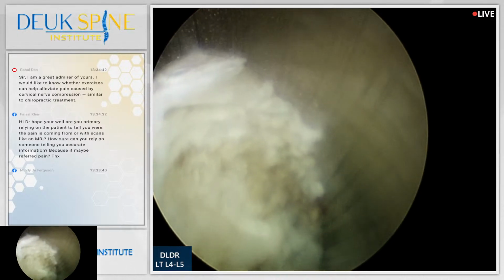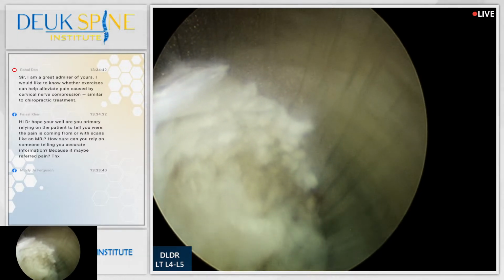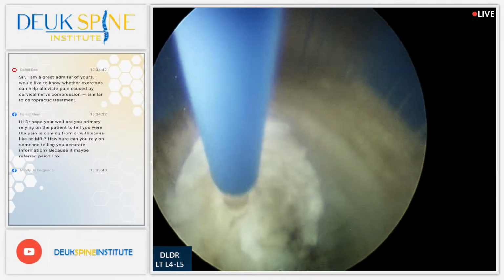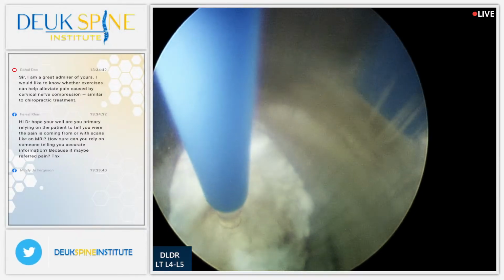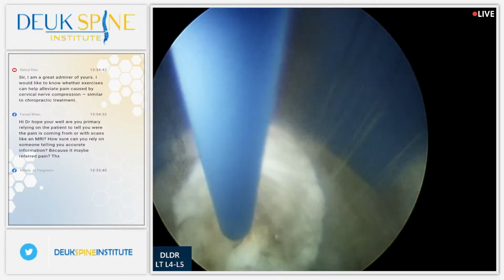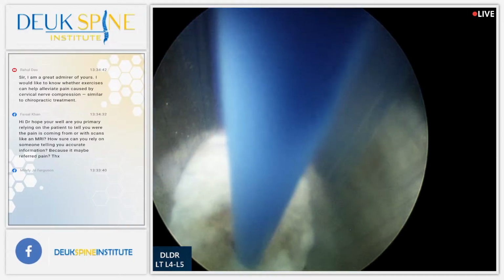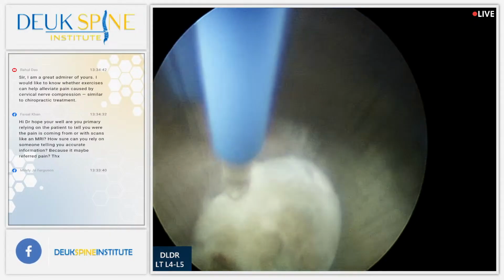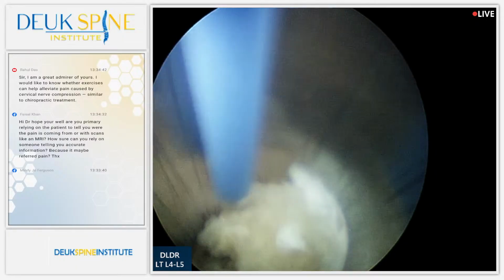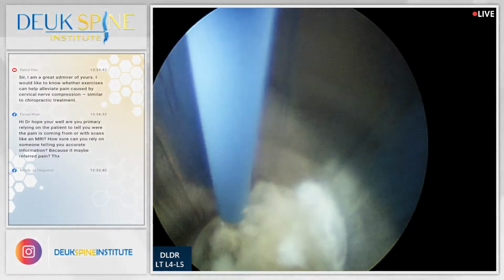And welcome back. We have been pulling out pieces of herniation now for the last 5 minutes. We are using our laser. That's the laser ahead of you. The glass fiber is 1 millimeter thick. That's how wide it is, diameter. And we're using this laser to clean up the tear that is at L4-5 on the left side.